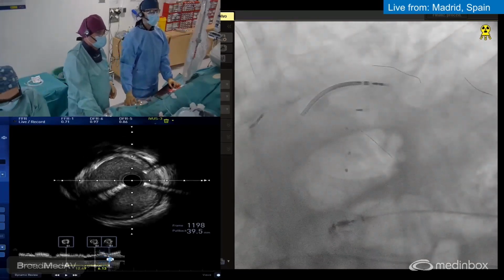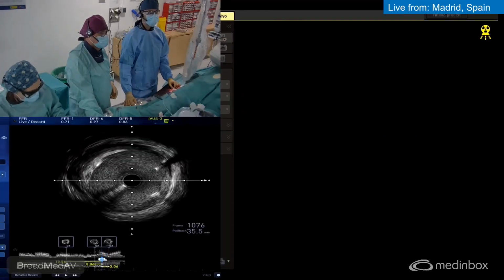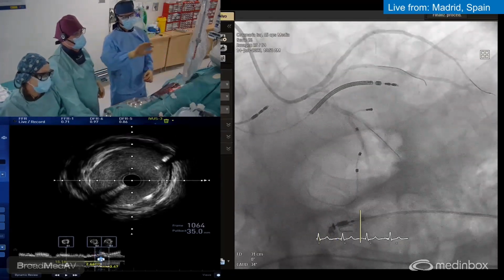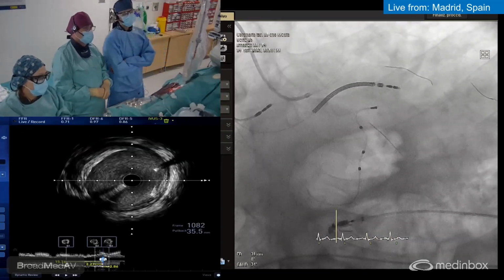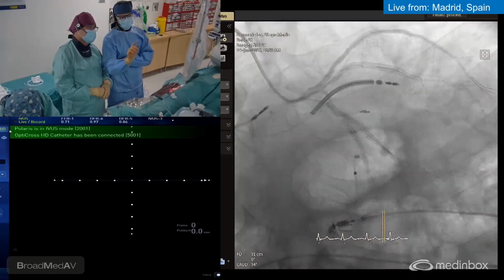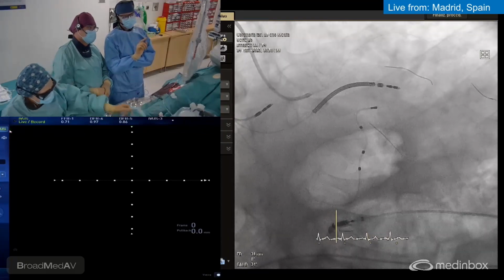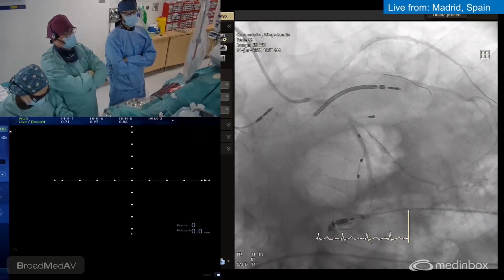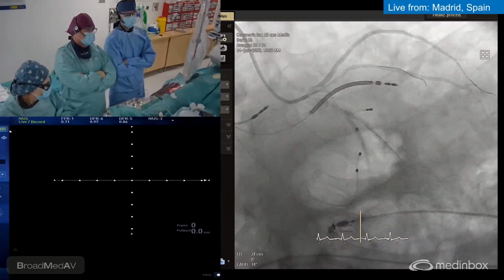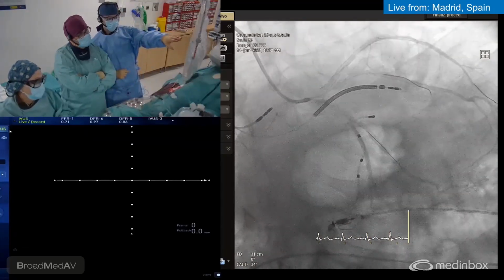Contraste, por favor, que habrá agua. Okay. Indeed, I think I have crossed outside the stent. You know, the branch is a little bit distal to the stent, and probably we have not crossed through the stent. You see? We can know it by IVUS. Dices que no hemos cruzado por el stent. No lo sé. Si la segunda guía pasa o no por dentro del stent.